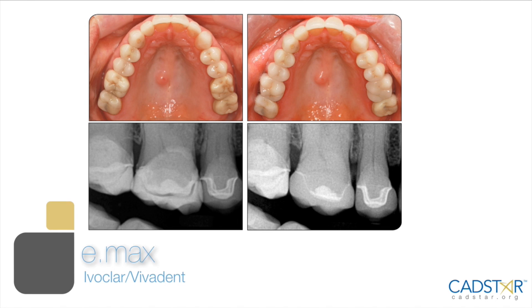The second premolar is a lab restoration accomplished back in 1997. In fact, all the anterior teeth to the second premolars were accomplished with Empress — I did that case back in 1997. Ceramics can last a long time, and with Emax, we know they're going to last a lot longer.